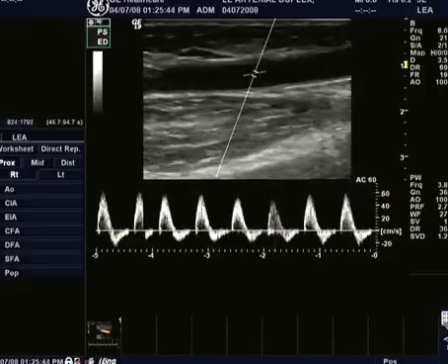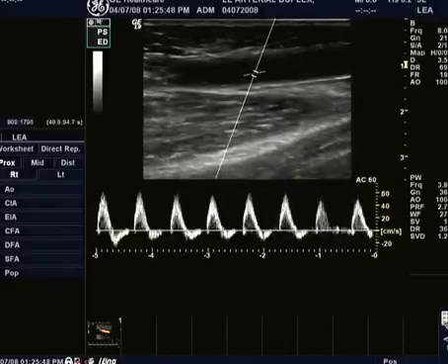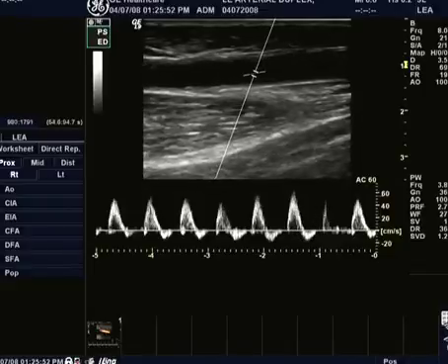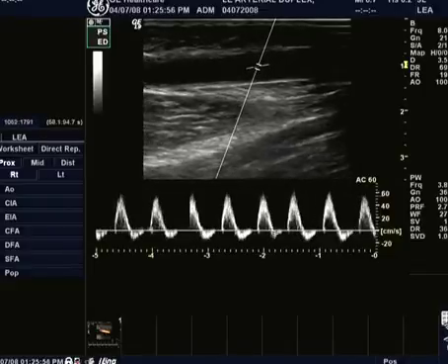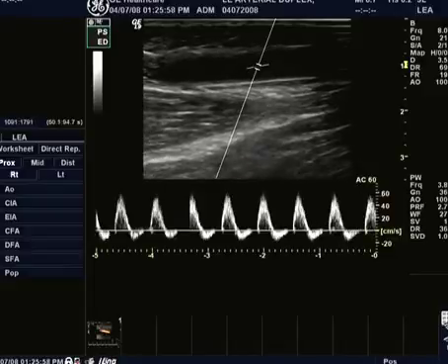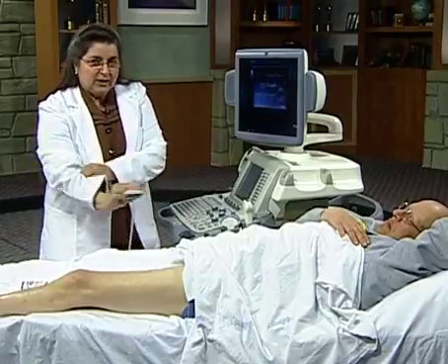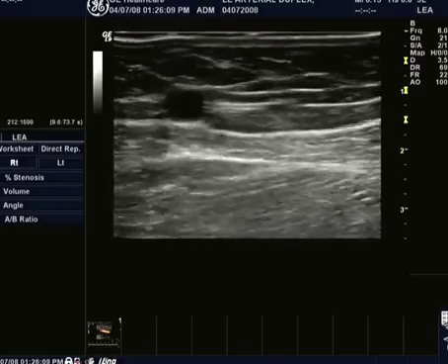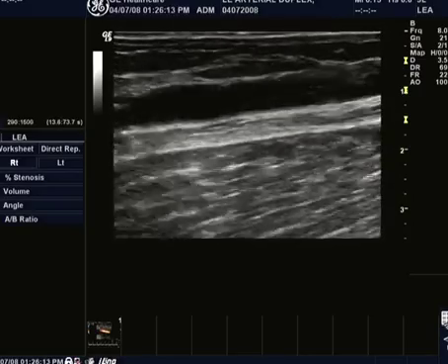So continuing on down, we see nothing on the grayscale. It looks beautiful. It's nice and healthy. And we're just moving along, and you can appreciate, you can hear the Doppler, you know that that's good flow. I'm just getting a little bit low here on gel, so we'll put a little more gel. I don't like to use a lot of gel because it tends to really cool off the patients a lot, so I just kind of use it a little more sparingly than some folks maybe.